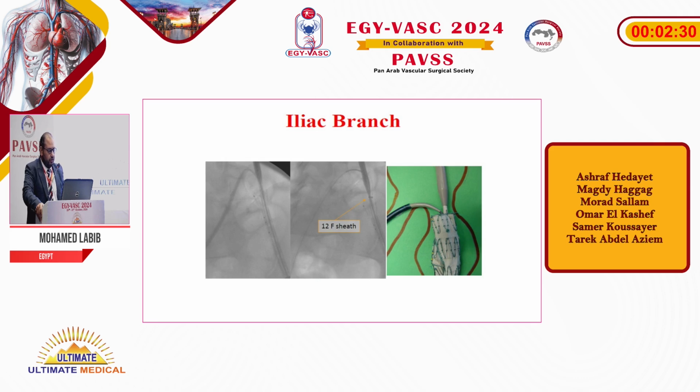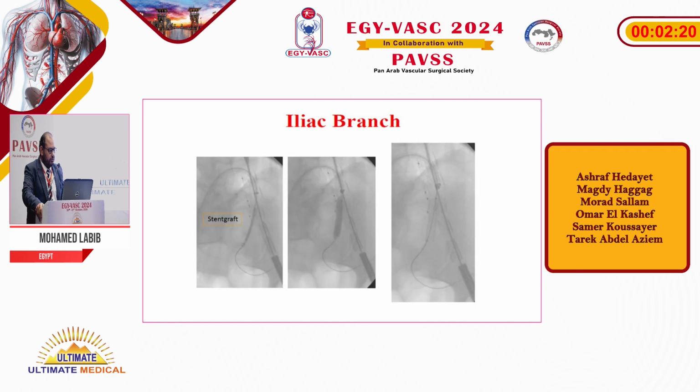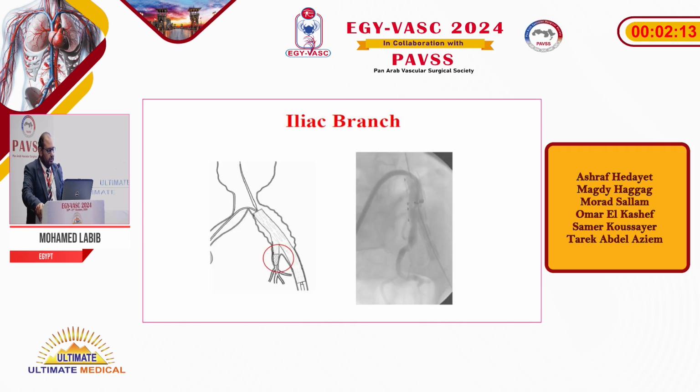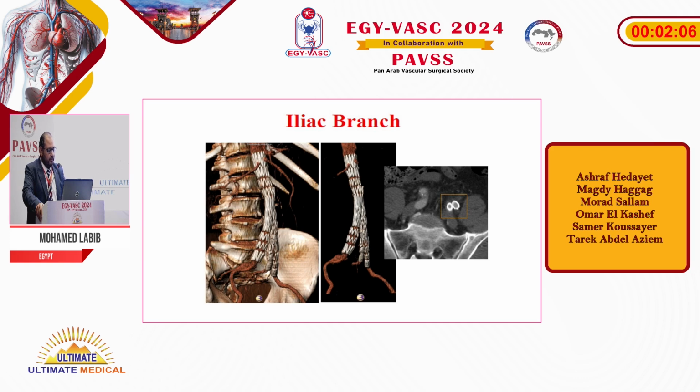Then introduction of the 12 French sheath, and inside it the 7 French. Then cannulation of the internal iliac artery and exchange of the floppy wire with a Rosen wire, and introduction of the internal iliac graft stent. After that, complete deployment of the iliac branch and complete deployment of the EVAR, and this is the follow-up after the EVAR procedure. No endoleak was detected, and the hypogastric artery on the left side is patent.